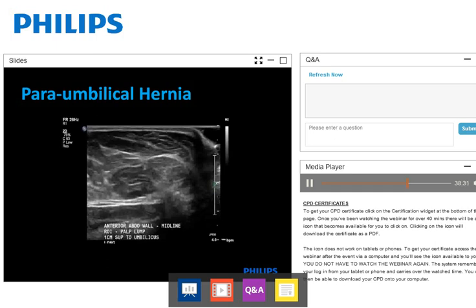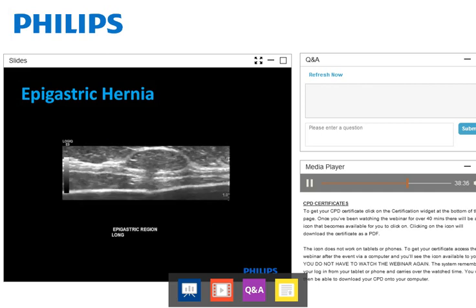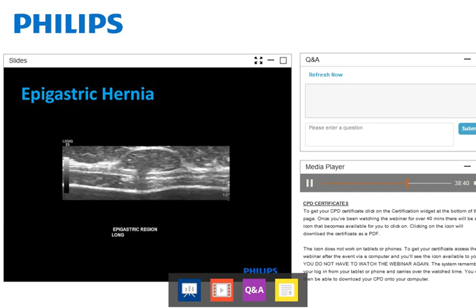You can get these hernias up high in the epigastric region. This is a pediatric patient we had not that long ago, and these ones often are not reducible. And you can see there's very, very little movement going through that defect in the fascia. You just get the hint of some fat moving in and out. So often with these ones, they're very tight, they're very firm. You don't get much of a movement through the defect in that linea alba, and they are often incarcerated. They can't be pushed back.